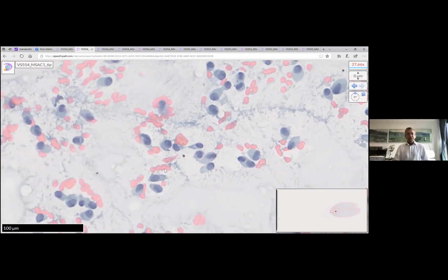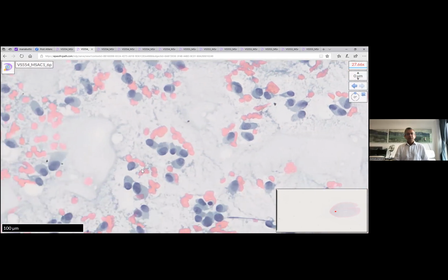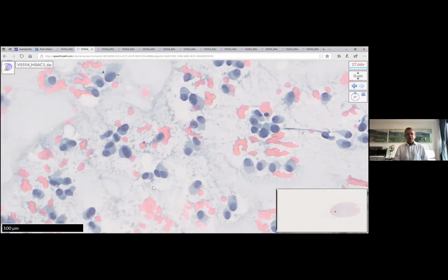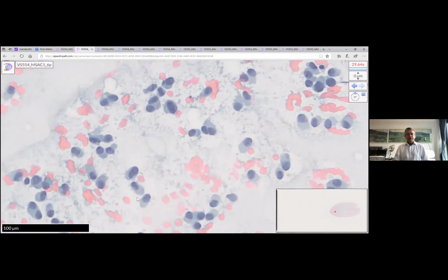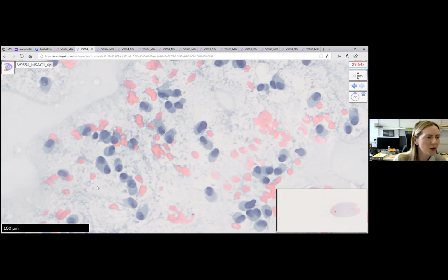Okay, some answers are starting to trickle in now. Malignant, carcinoma, melanoma, medullary, lobular. We've got a good range of differentials there. Dispersed atypical single cells, eccentric nuclei, lymphoid background, plasmacytoid cells, differential diagnosis of melanoma, plasmacytic neoplasm, lobular breast, etc. Suspicious of metastatic. Yeah. Thank you so much for all these suggestions and being such good, keen participants, because obviously all the ones that you suggested would be very valid and incorporated into a differential.